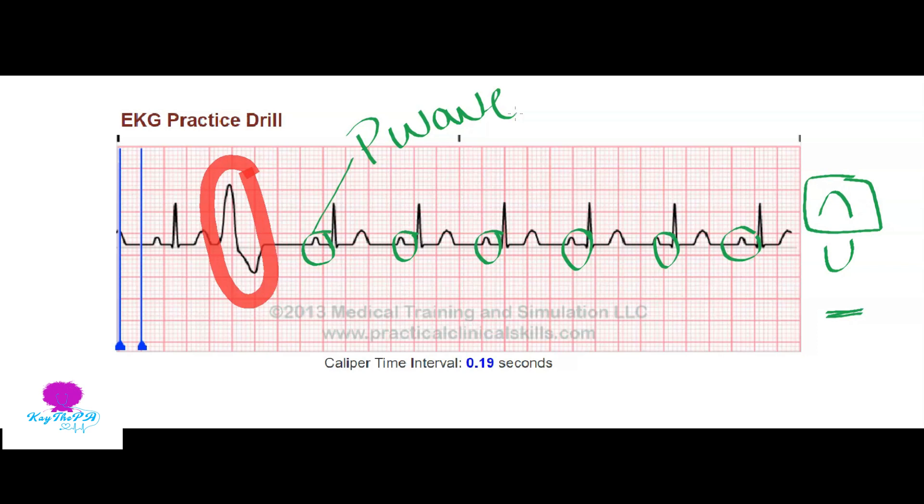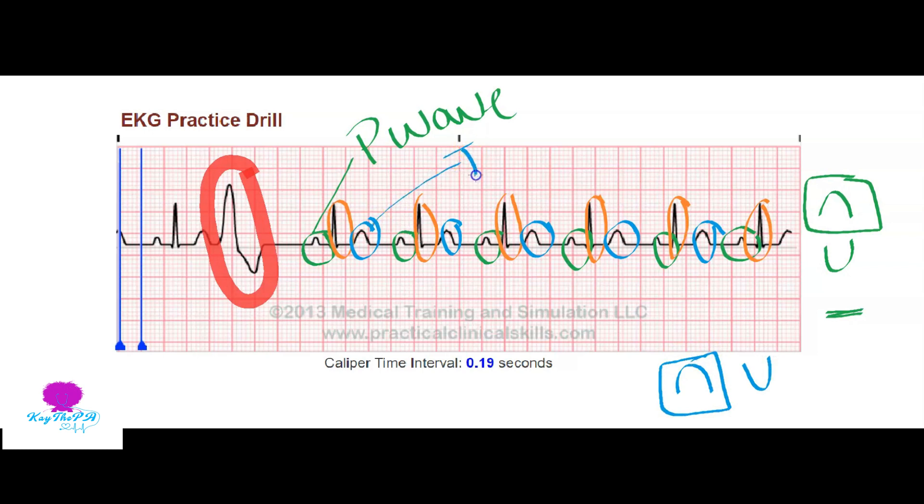Next we're going to look for our QRS complex. The QRS complex has the Q, the R, and the S wave. We have one here, here, here, here, here, here, and here - so every P wave has a QRS, which is perfect. Now we're going to look for our T wave. You have to make sure it's upright - sometimes T waves can be inverted. Our T waves are upright, so they are good.